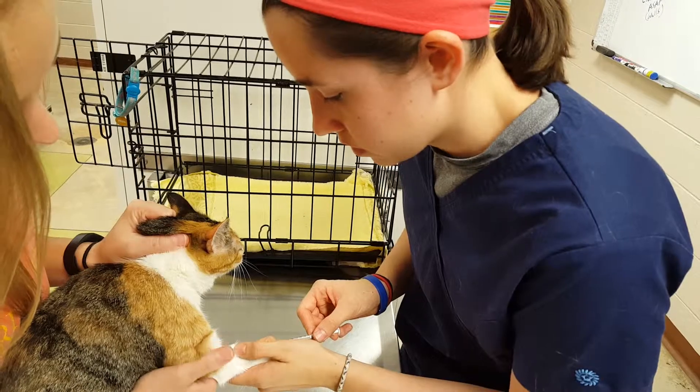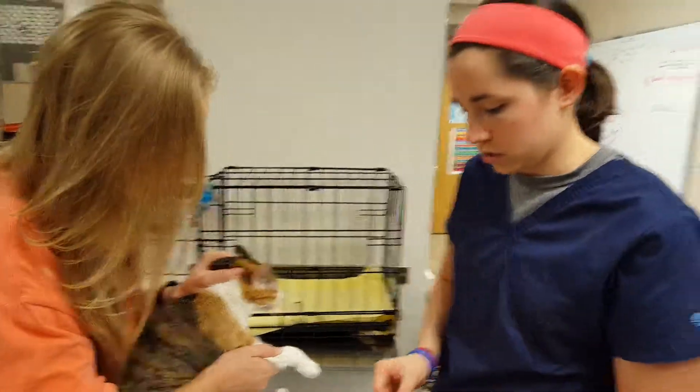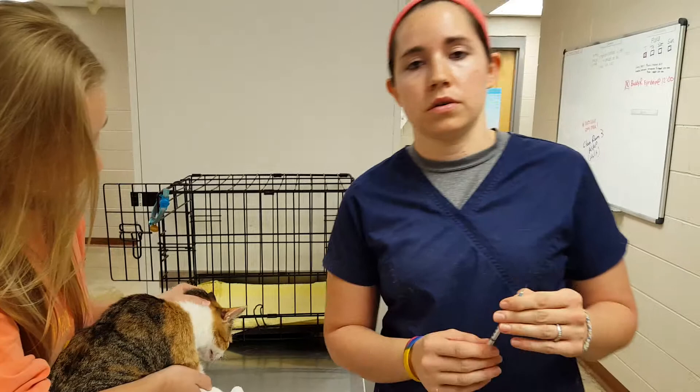Okay, you can let go. Hold that off for at least 30 seconds so we don't get a hematoma. I'm going to take this blood to do our test.